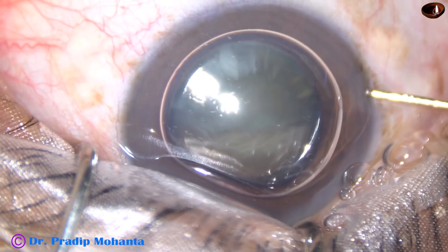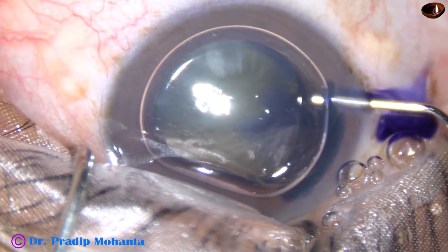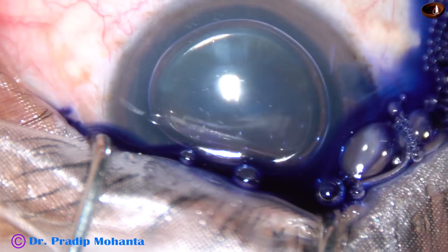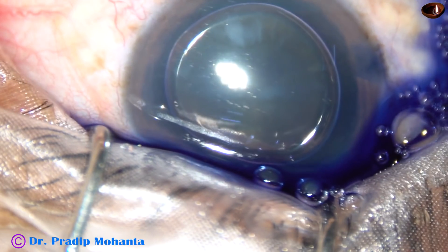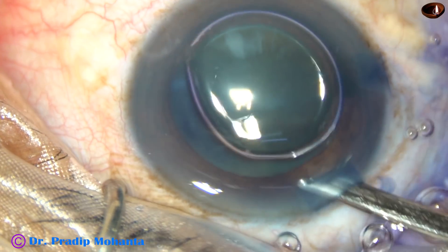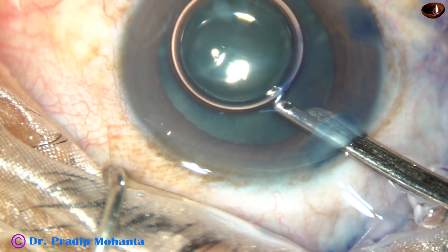If we use an air bubble, the staining is immediate and we need very little amount of dye. The dye doesn't touch the corneal endothelium. The dye is washed out.